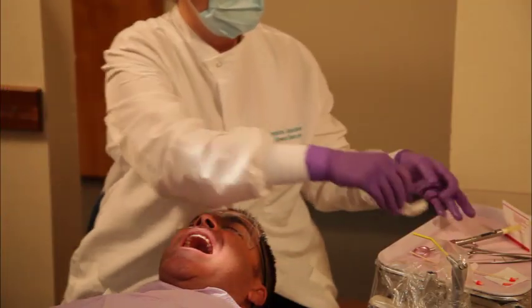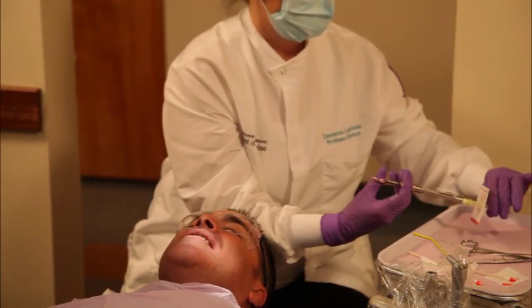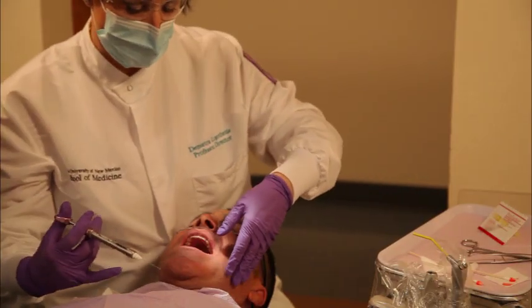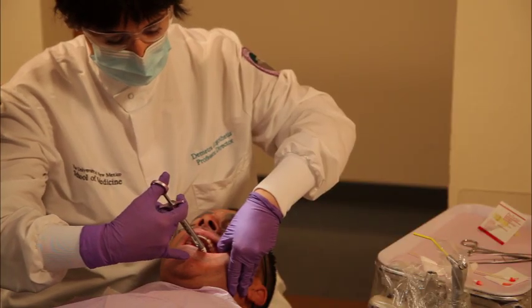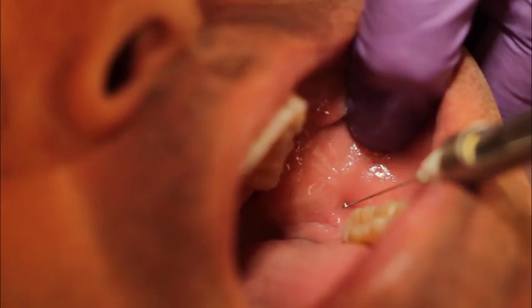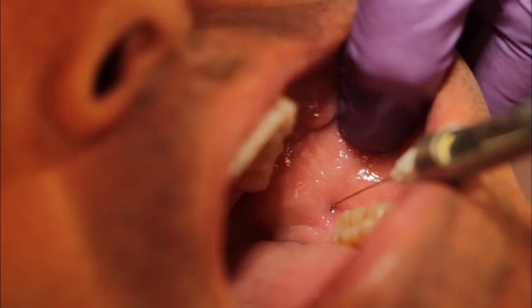Using a 25-gauge long, same needle setup as the IA block if given together, or a 27-gauge short needle if given alone, orient the bevel toward the bone and large window toward yourself. Establish a fulcrum that allows you the greatest stability of the syringe. Direct the syringe barrel parallel to the occlusal plane, but directly superior to the mandibular molars.